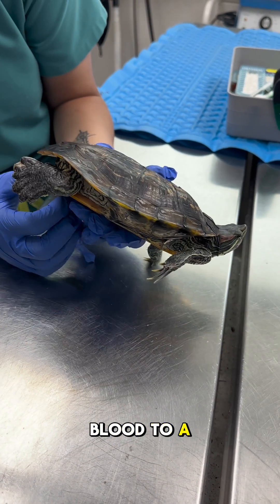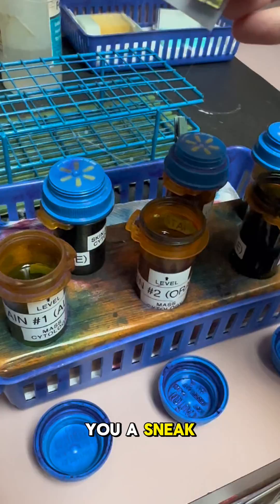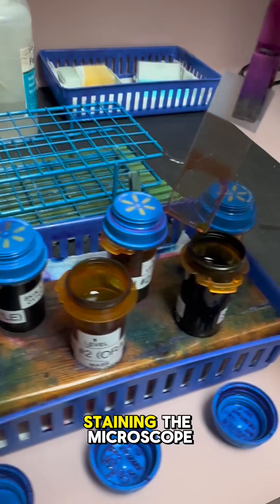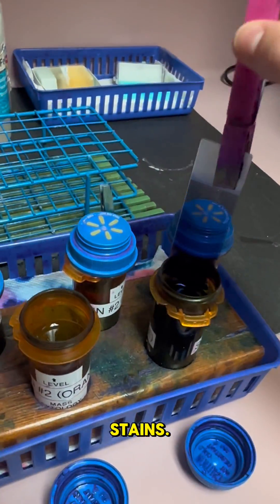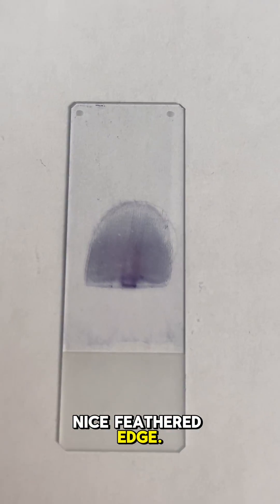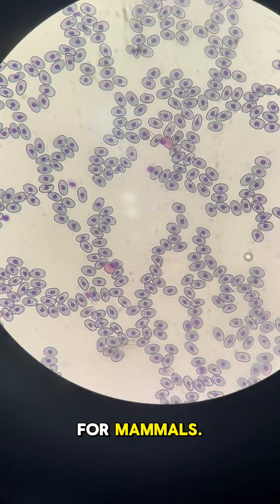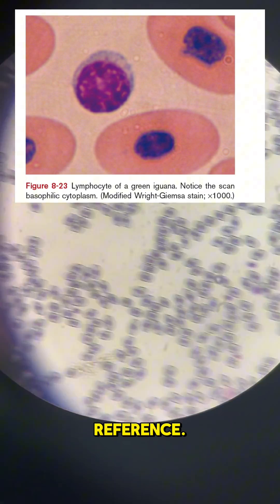Although we send out our reptile blood to a lab to be analyzed, here I'll give you a sneak peek of what their blood cells look like under the microscope. Here I am staining the microscope slide using some special stains. The blood smear should have a nice feathered edge. Red and white blood cells can look pretty different for reptiles than they do for mammals — I've included some pictures throughout this video for you to use as a reference.